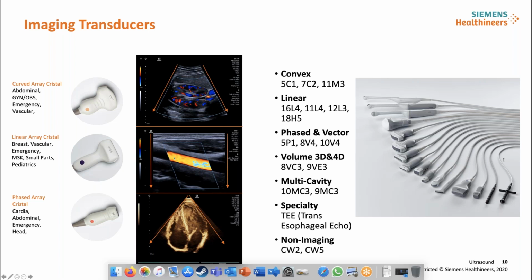You can control the whole system with the probe. So I would say 3 to 4 meters is perfect. Usually that's enough. You can do a bit more, but you have to make sure that the connection is still good. Some places use this. Kuwait, they use this a lot. I think in Saudi, a few places have this setup, an isolation room with a glass, and they can leave the machine outside and protect the transducer with a small plastic bag, which is a sterile bag designed for this, of course. And so they don't have to spend too much time on sterilization. It's very nice.